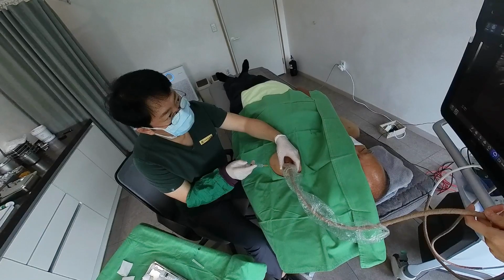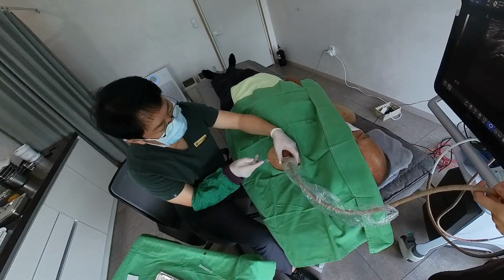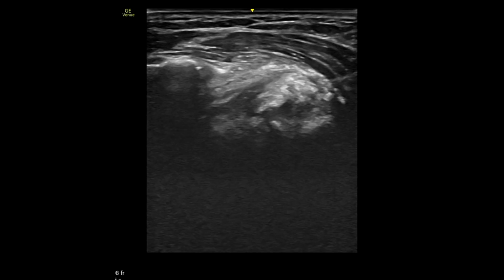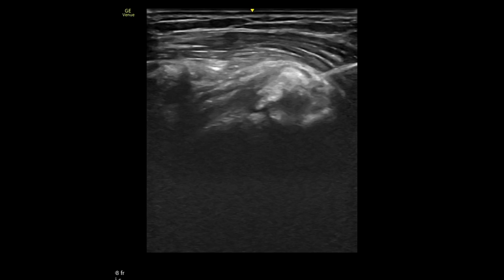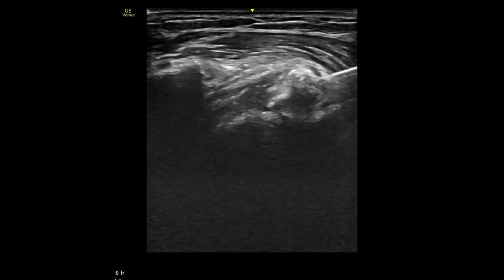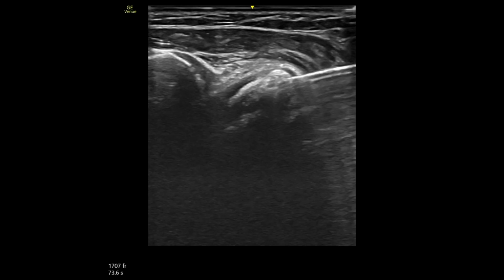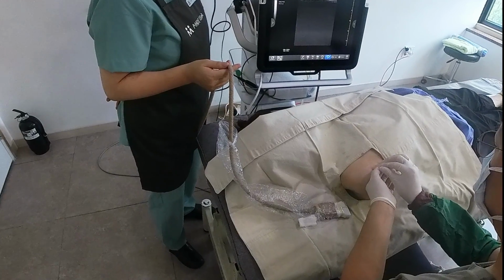Local anesthesia. Using a 26-gauge needle, administer local anesthesia starting from the skin surface and progressing to the subdeltoid bursal space. Calcific deposit localization. Use the ultrasound to align with the long axis of the calcification. It ensures precision and safety during the procedure. Needle insertion. Introduce the 18-gauge needle into the calcification center. Do not adjust or relocate the needle once it penetrates the calcium capsule, as it can cause leakage of the injected fluid.